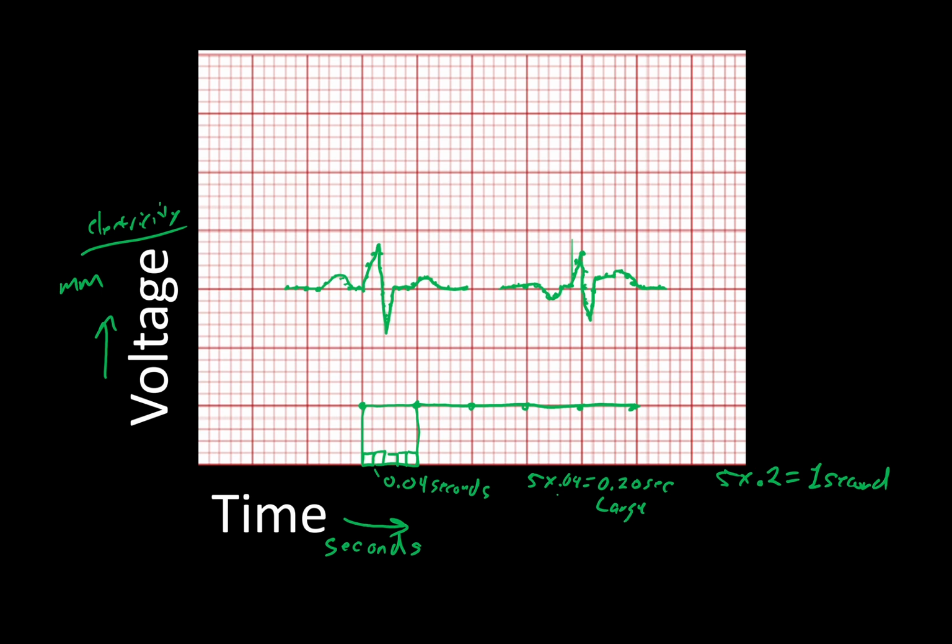Those are the ideas behind it. It's just an instantaneous measurement of all the electricity in whichever direction it's flowing.